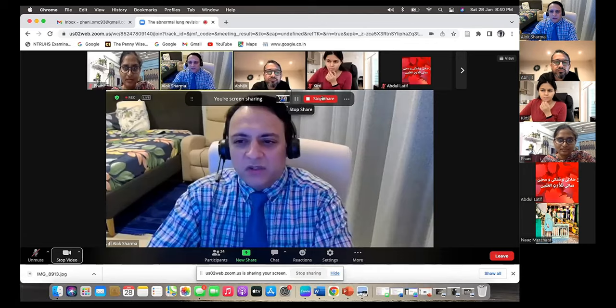I suspect that's probably depth. So I think your depth is okay, but just be careful of not interpreting that loss of image acquisition as consolidation. So you did have a nice consolidation there in one of the images, but I tell you what, Kirti, can you share those images again next time?